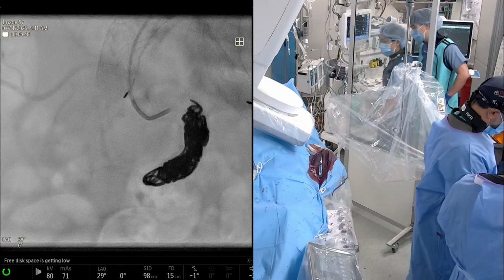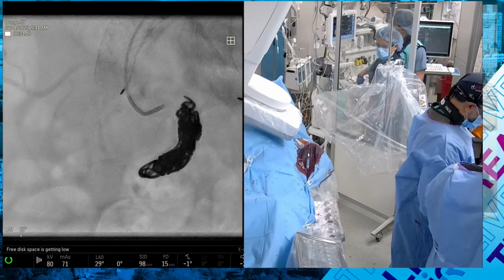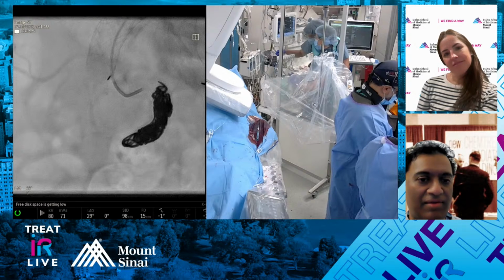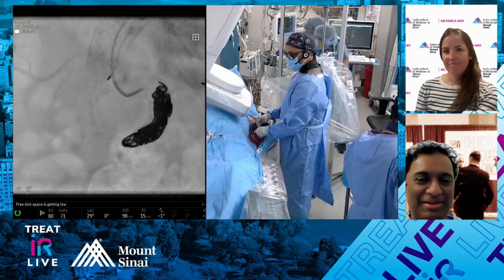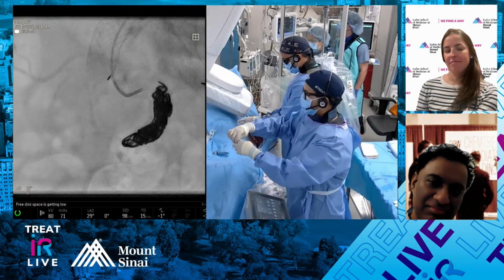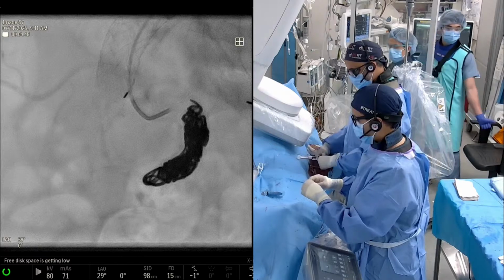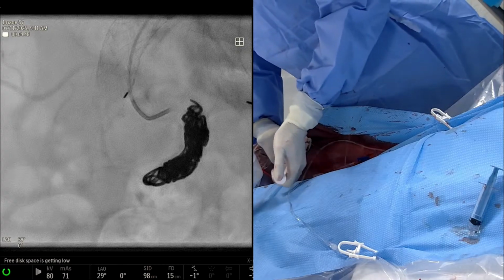Yeah, for sure. We have a lot more patients coming in either on half dose or full dose. I find these patients are on anticoagulation for whatever reason, especially if they have a mechanical mitral or aortic valve, and the INRs are really high, these endoleaks sprout. So it's very hard. Exactly. We've had this conversation, not you and I, but I've had this conversation with other people, about doing the angio on blood thinner, right? Because when you turn off the blood thinner, it goes away, but then you turn it back on, and it comes back. You're right. I think that's a very good, valid point.